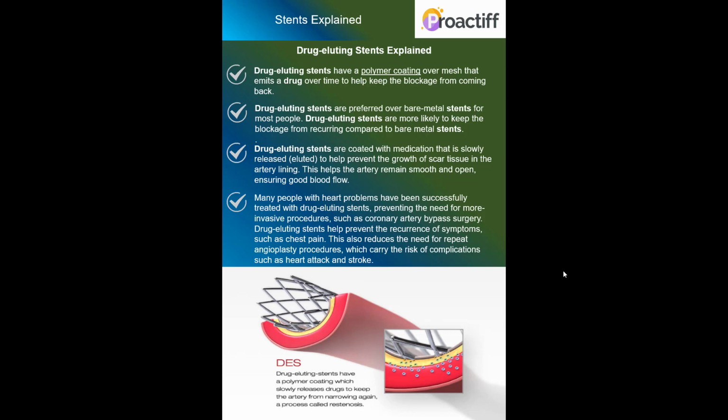Now, what is DES? It's essentially the drug-eluting stents. This is another variety of the stents that have a polymer coating over the mesh of the wire that is put through, so as to emit a drug over time to help keep the blockage from coming back. So once the blockage is circumvented with the stent, the polymer coating with the drug protects basically so that there is no blockage formation again.